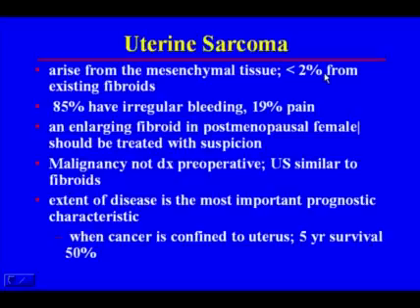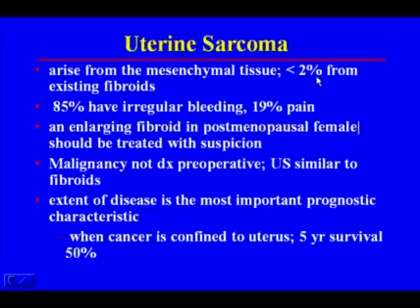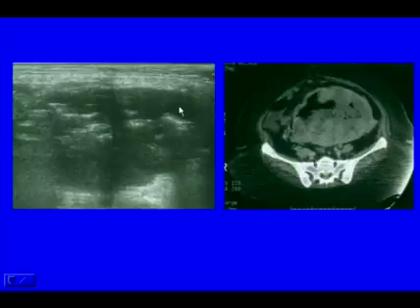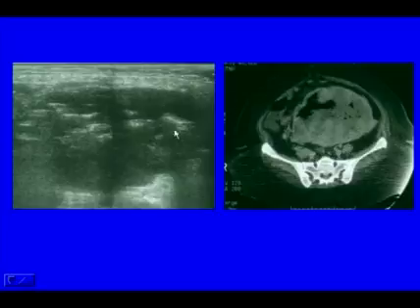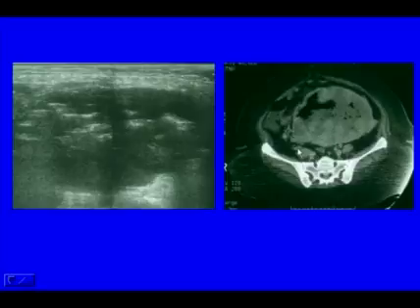The extent of disease is very important because it determines prognosis — when cancer is confined to the uterus, the five-year survival can be up to 50%. A case is shown where transabdominal ultrasound revealed a heterogeneous uterus with echogenic linear structures and shadowing, and CT confirmed gas within the mass. This was a necrotic uterine sarcoma.